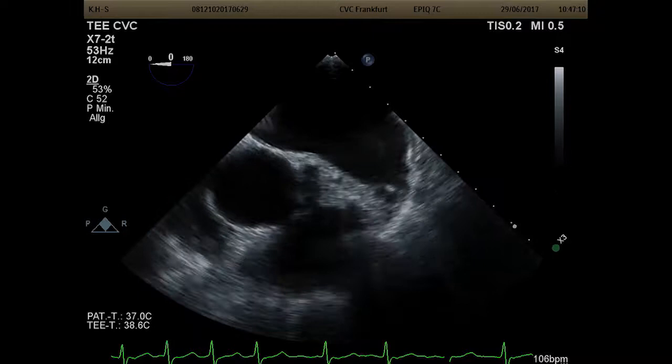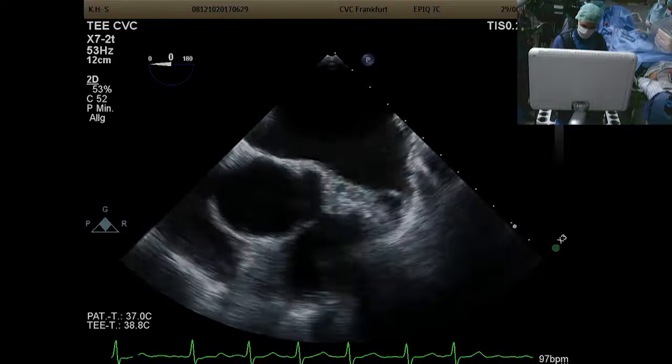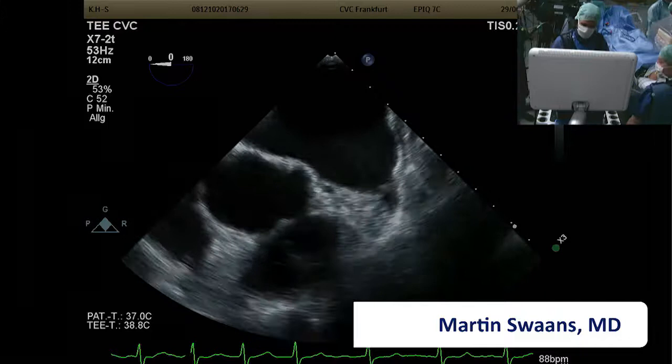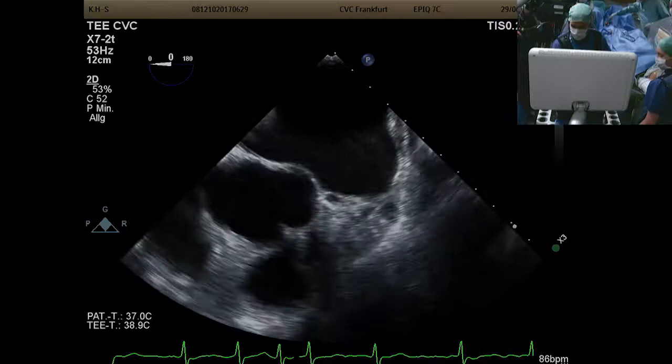At 45 and 90 degrees you can nicely assess the depth of the LAA, but frequently it's oval-shaped, and the biggest diameters of the LAA are seen at zero and 135 degrees. You can nicely see live the spontaneous contrast in the LAA, indicating slow flow.